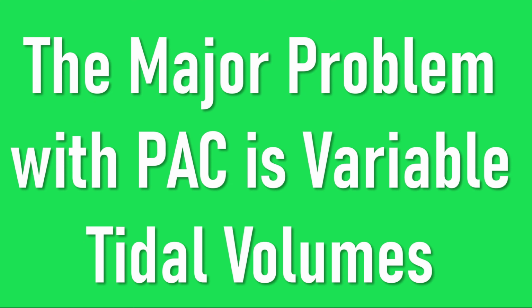The major problem with pressure control ventilation is variability in tidal volume. While you may set an inspiratory pressure based on the tidal volume that is delivered by the first few breaths, you cannot be sure that the ventilator will continue to provide that volume. If the patient turns in the bed, moves their head, if the lungs stiffen up or loosen up due to a large diuresis, if there's a kink in the tube or an airway plug, the tidal volume may fall or rise dramatically. Now that's okay if the bedside practitioner, for example a nurse or respiratory therapist, is watching the volumes carefully. But when they are inexperienced or distracted, for example setting up lines or infusions or dialysis or helping with turns or proning, then there may be a problem.